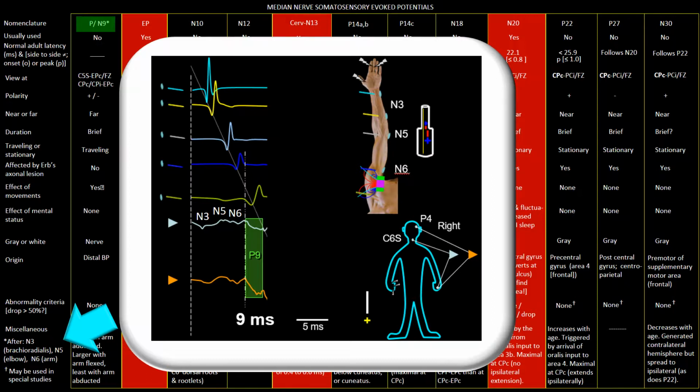Take a few seconds to look at this frame to orient yourself regarding the montage being used. Although not shown in this figure, as electrical activity traveling the median nerve from the hand to the shoulder goes through changes in direction following the anatomical course of the median nerve, and changes in volume, conduction, size, and medium in its course, the production of far fields takes place. These far fields can be recorded at the neck and at the scalp as minor deviations. These far fields are recorded in addition to near fields recorded by bipolar recordings between the subcutaneous needle and the close placed reference electrodes.